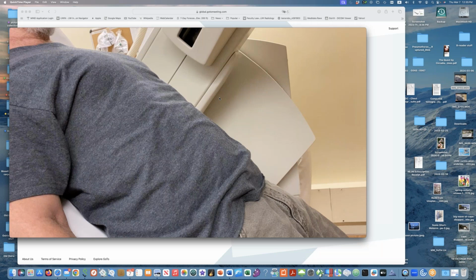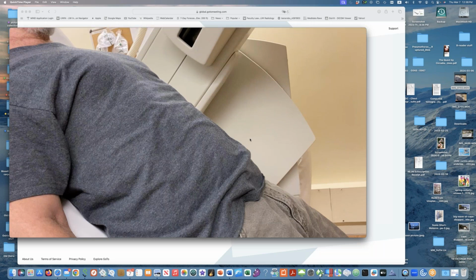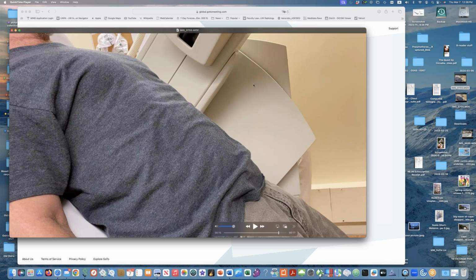So the guy's due back in the clinic tomorrow, and so I'm going to do a sniff test on him again tomorrow, and we'll see how much better he is. But I thought this was a dramatic example. It's the one time I have a video to show you abdominal paradoxical motion. So once again, if bilateral paralysis is an issue, you have to include supine views on your sniff test.